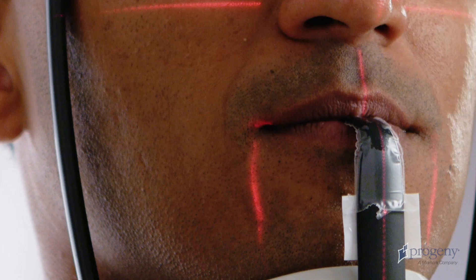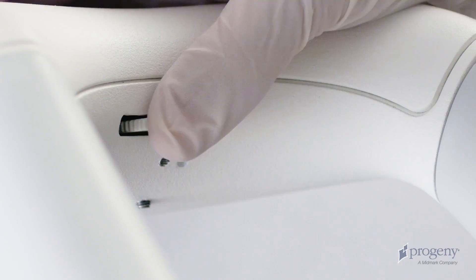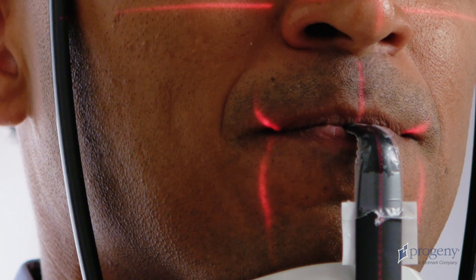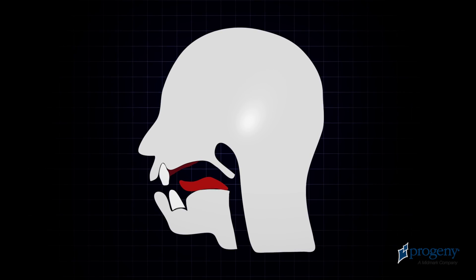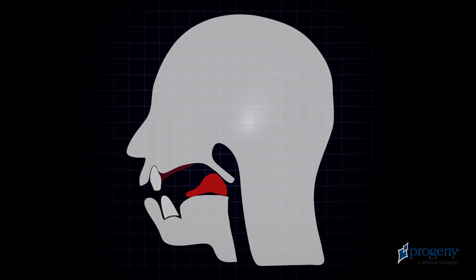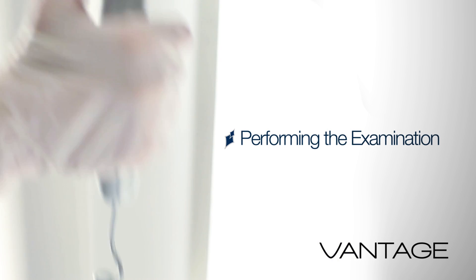Inform the patient to remain still. Ask the patient to smile and align the cuspid laser with the leading edge of the cuspid. Instruct the patient to close the lips around the bite piece. On the control panel, tap the cycle button once and verify the green ready condition. Instruct the patient to place the base of the tongue to the roof of the mouth as if swallowing. Ask the patient to remain still and hold their breath for the duration of the scan.